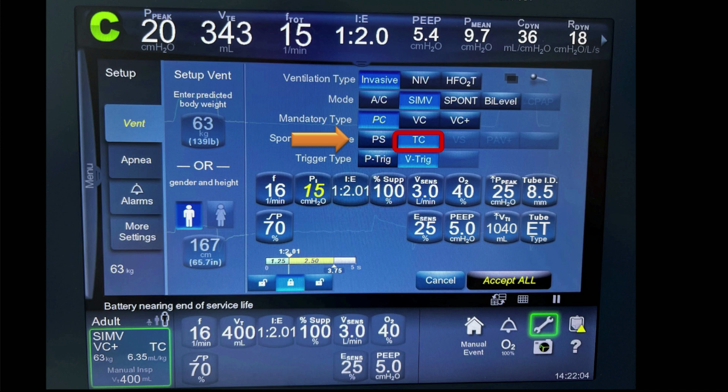The next thing that you absolutely must do is tell the ventilator what type of tube the patient has. In this situation, we're telling the ventilator that the tube is an 8.5 millimeter internal diameter endotracheal tube. That's the bit on the bottom. It's imperative to make sure that this is the correct tube, ET tube, not tracheostomy, and vice versa.